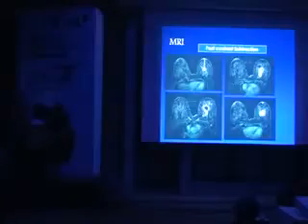As I said, and I'm always telling you, a simple cyst does not enhance. Or it might have a very, very thin, uniform enhancement of its wall. Very thin, uniform enhancement. But what do we have here? We have a very thick enhancement of the wall of the cyst. Is that all? No. Look at this. What are these doing here? And what is this doing here? This is a mass. And what is this linear enhancement that's going up to the nipple?